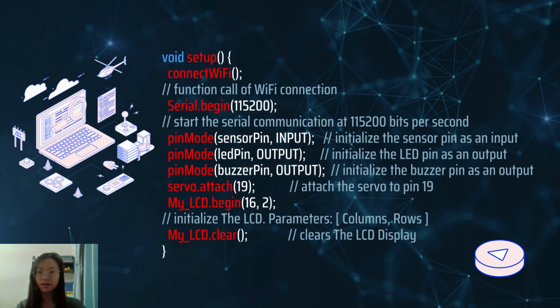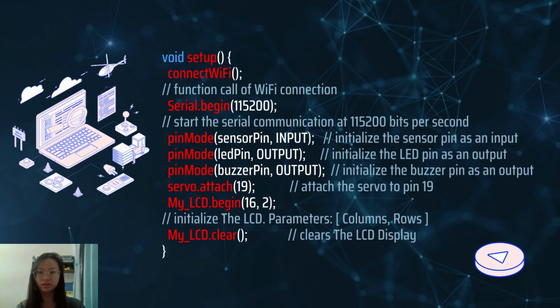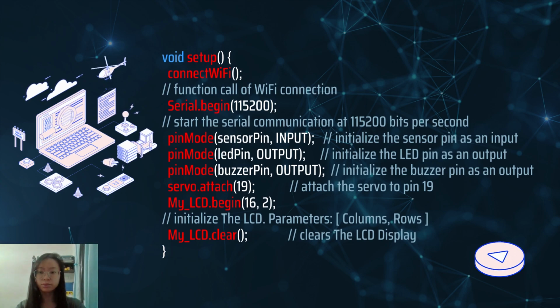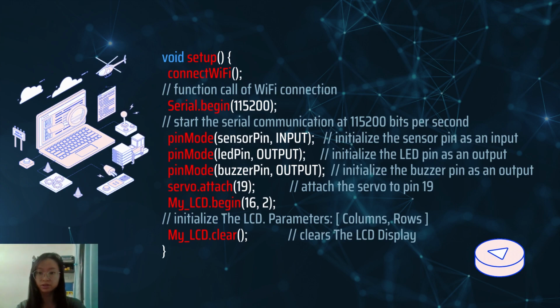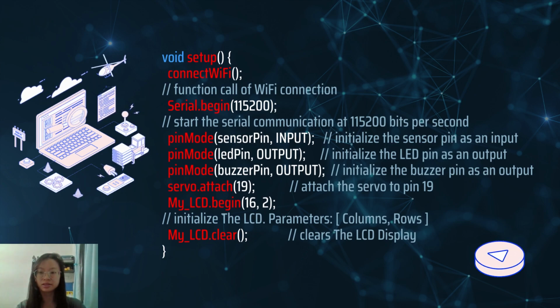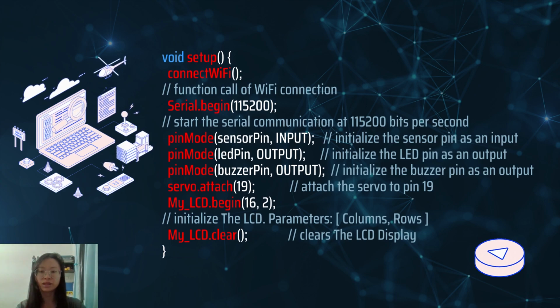The setup function is used to initialize the board before it starts running the main program loop. The connect Wi-Fi function is called to connect the BLINK and ESP32 via Wi-Fi, as explained previously. Next, Serial.begin(115200) is called to initialize the serial communications at a baud rate of 115200 bits per second. pinMode would initialize the sensor pin as an input, while LED and buzzer pin as output.